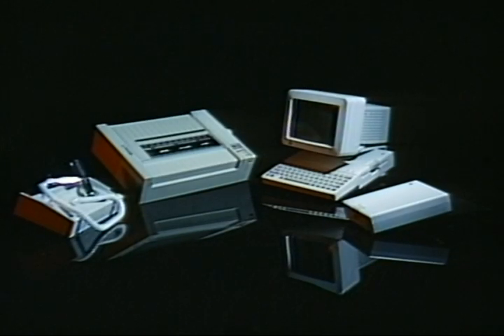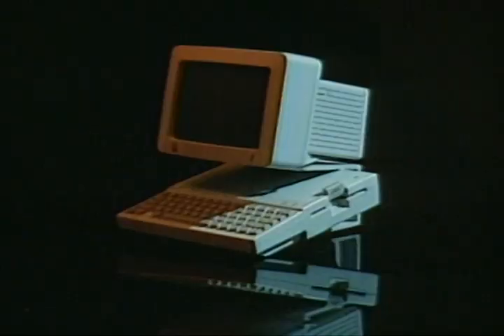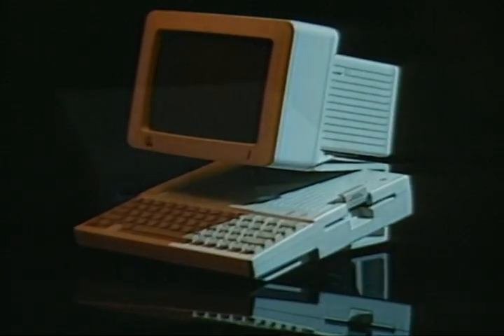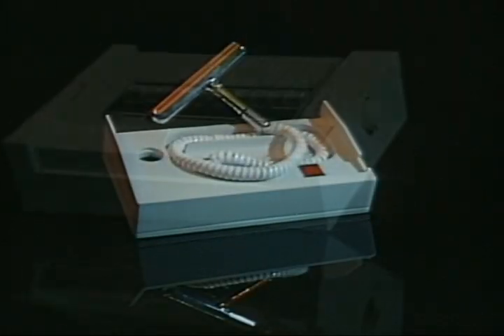GST proudly introduces the GST Thermal Profile System, an effective, low-cost thermal imaging system for sensing and depicting temperature distributions over the surface of the body.